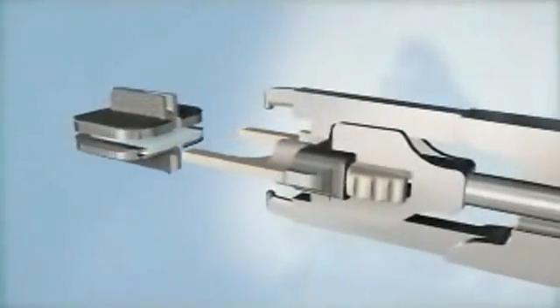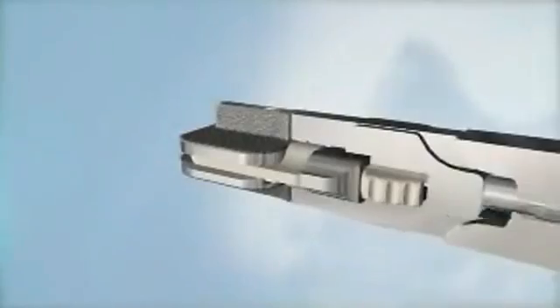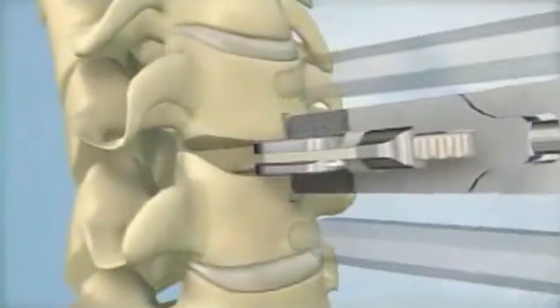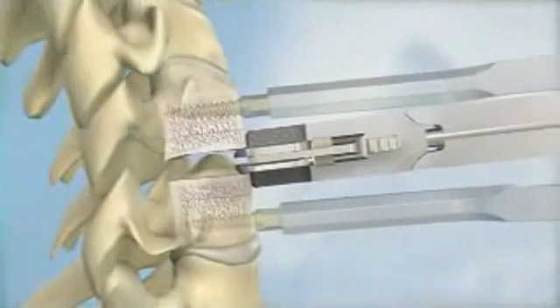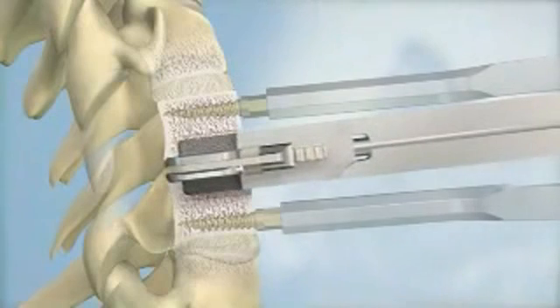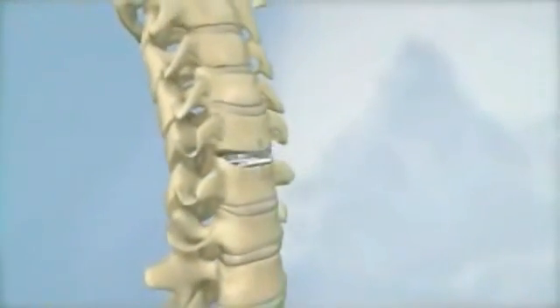After the keel channels have been prepared, the vertebral bodies are ready to be implanted with the ProDisc-C implant. The implant is attached to the inserter, the keels are aligned with the keel channels, and the implant is inserted en bloc into the vertebral bodies. The instruments are removed and the final implant placement is confirmed.